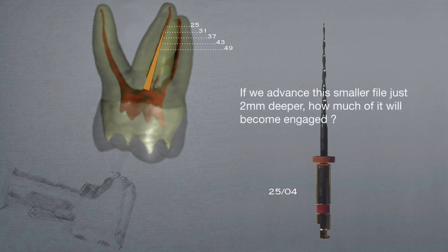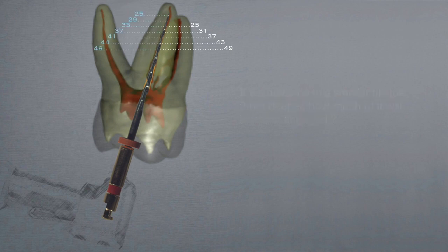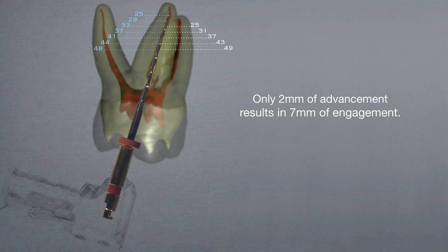If we advance this smaller file just two millimeters deeper, how much of it will become engaged? Only two millimeters of advancement results in seven millimeters of engagement.